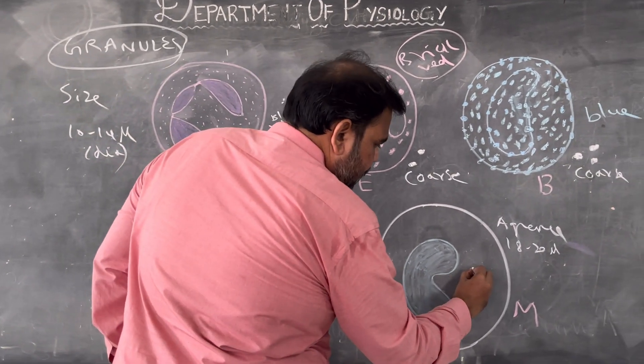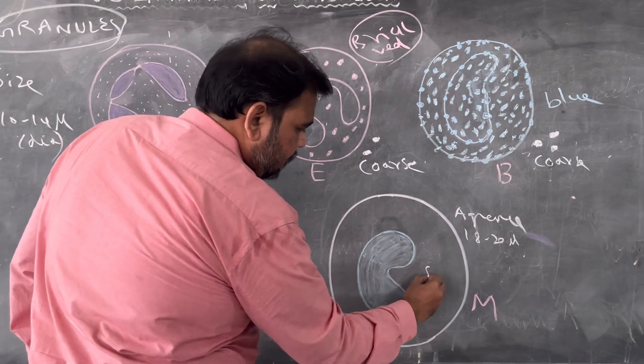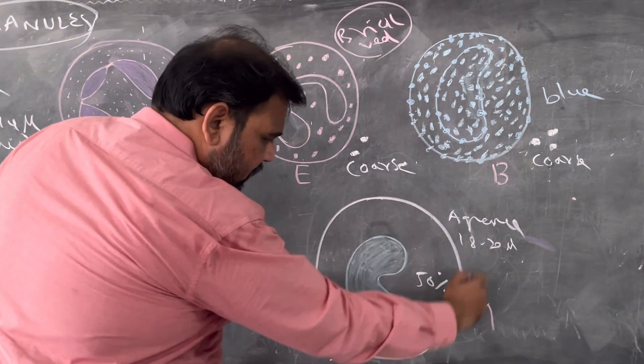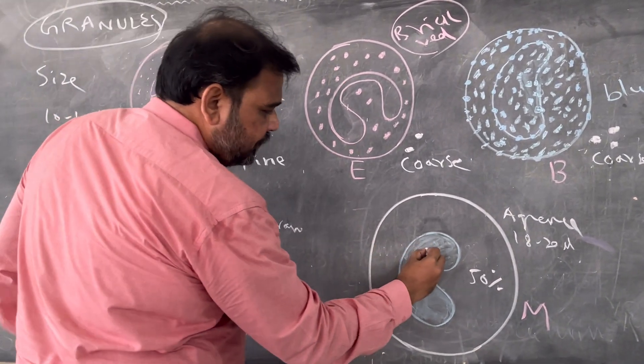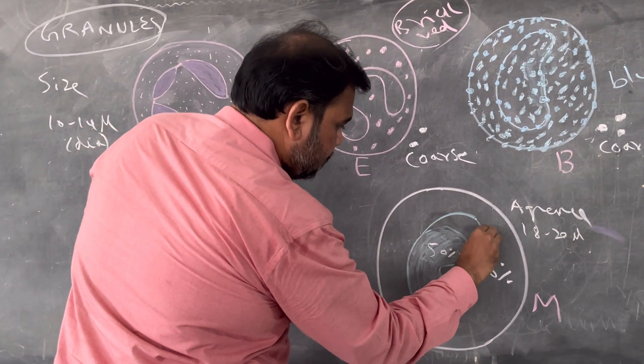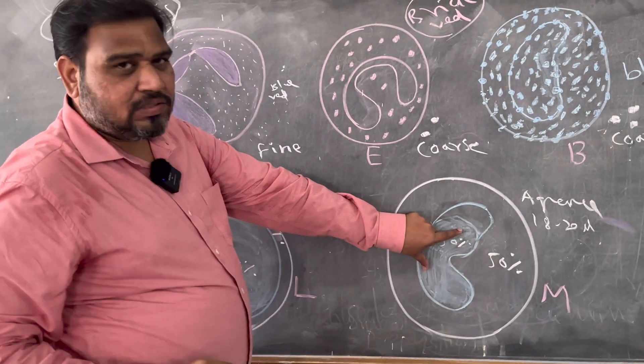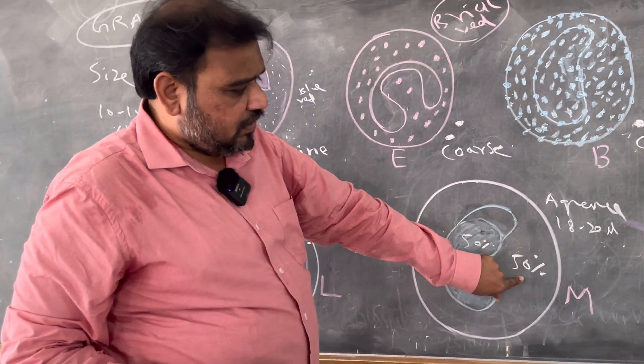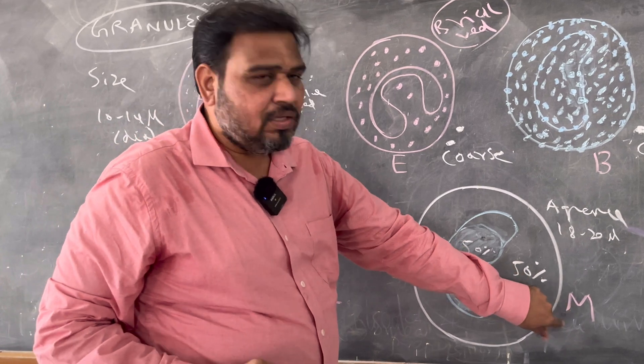Here you see, 50 percentage will be cytoplasm, 50 percentage will be nucleus. So 50 percentage is nucleus, 50 percentage is cytoplasm, that is monocyte.